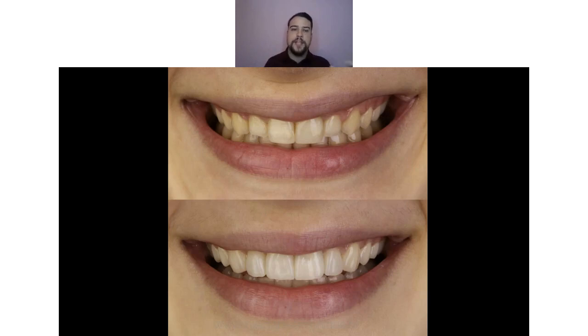Have in mind that your result cannot be better than your wax-up. So you need to find a great technician who will deliver great morphology, and then you can copy it in your patient's mouth. Sometimes I repeat the mock-up 2-3 times until I'm perfectly happy, and just then I go for the final treatment. It's not the technique itself that will give you a great result. It is your planning, or your technician's planning and modeling.